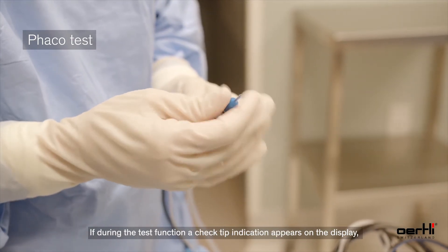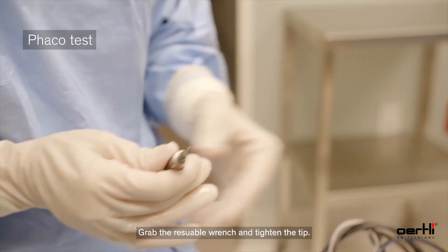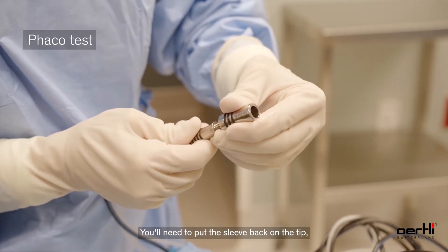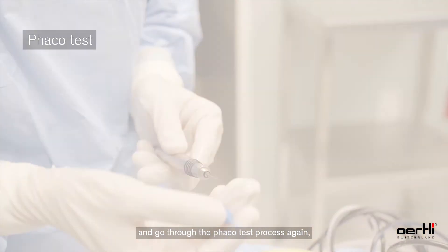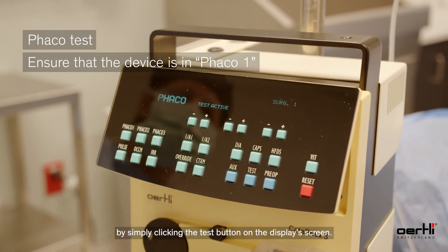If during the test function a 'check tip' indication appears on the display, simply remove the sleeve, grab the reusable wrench, and tighten the tip. After this process is done, put the sleeve back on the tip, reattach the test chamber, and go through the phaco test process again by clicking the test button on the display screen.